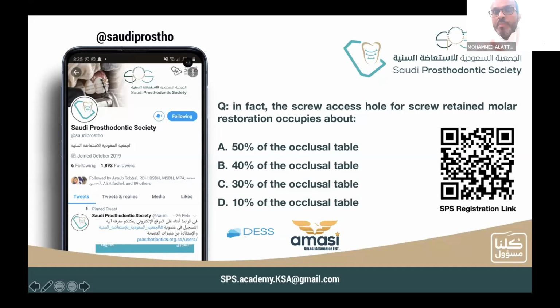Why? When you do the follow-up for the patient, or if any complication happens, you will remove only the separate fixed partial denture. But if you have a patient with parafunction or poor bone quality, you will definitely go for a one-piece prosthesis. So, if you have 8 implants, whether to do separate or one-piece depends on the situation of the case or the patient.